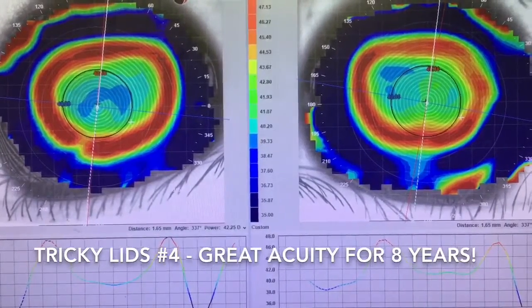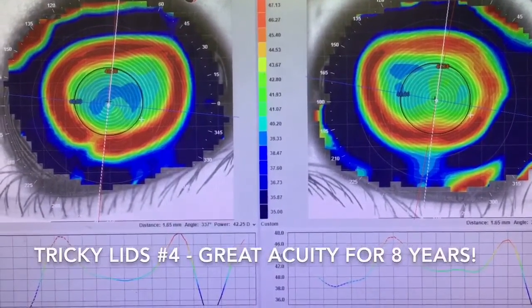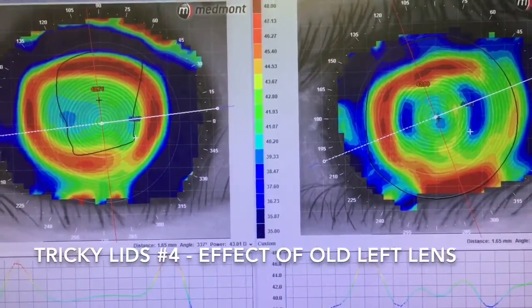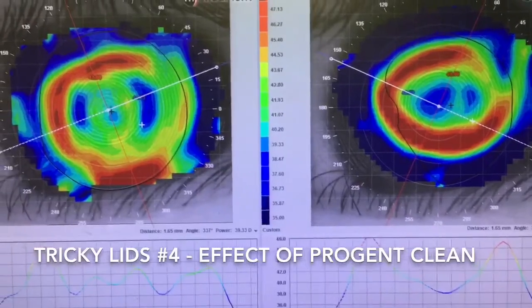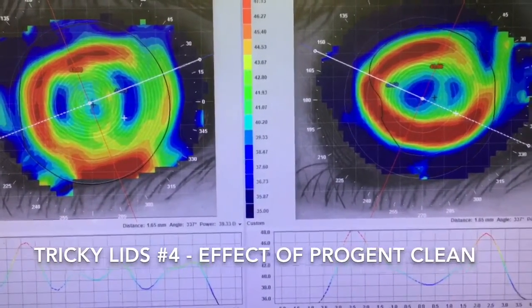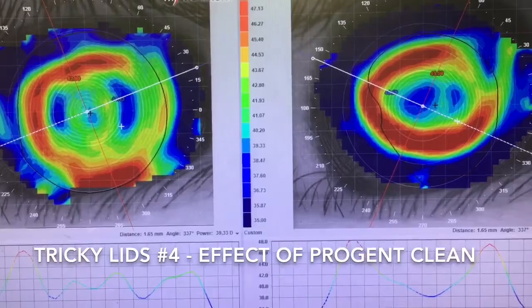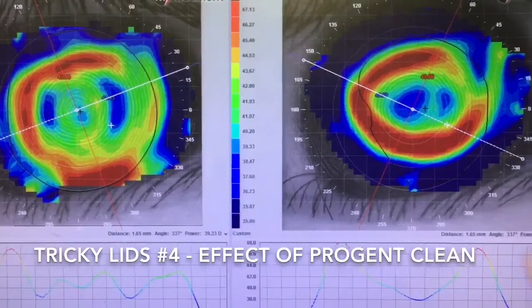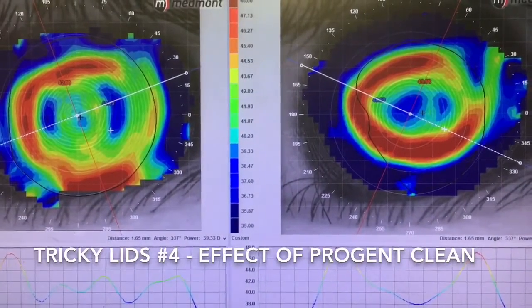Here's the topography of the patient with the nasty epiblepharon. This actually looks pretty good — the lenses are quite well-centered, but the treatment zones are a bit oval and that's likely from lid pressure. The left eye has all of that staining I showed before. The right eye is still treating quite well. Here's the left eye a couple of days ago and after a Progent clean — you can see it's improved significantly, with more regularity in the mires compared to last time.